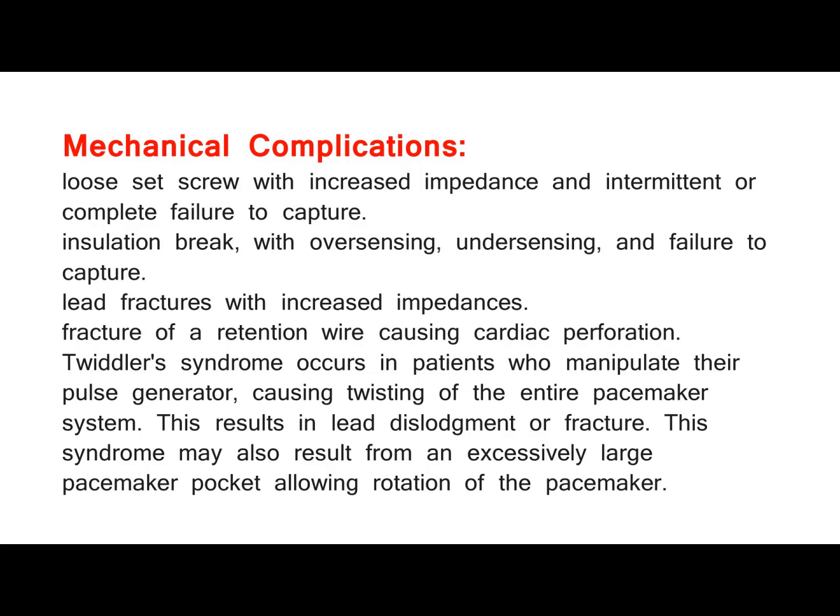Loose set screw with increased impedance and intermittent or complete failure to capture. Insulation break with oversensing, undersensing, and failure to capture. Lead fractures with increased impedances. Fracture of a retention wire causing cardiac perforation.